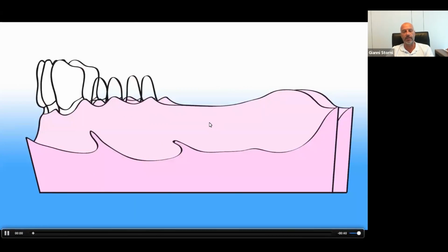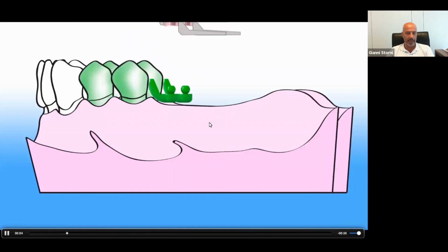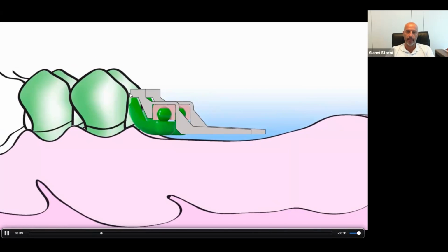We can see here a little video that shows you how the attachment works. You see the stop, it's closer to the crown, but it helps you to have resiliency on the distal. Okay, so very important: you choose the resiliency, and the fulcrum is closer to the teeth. So no too much overload on the distal during the masticatory forces.